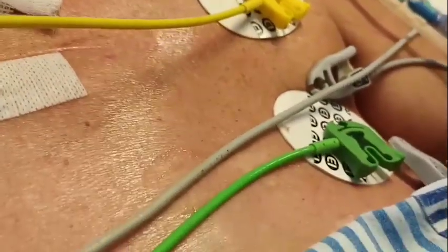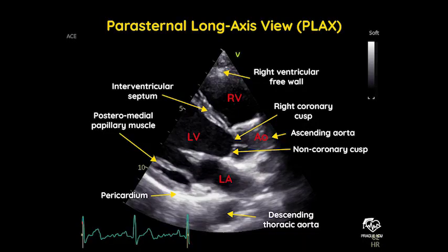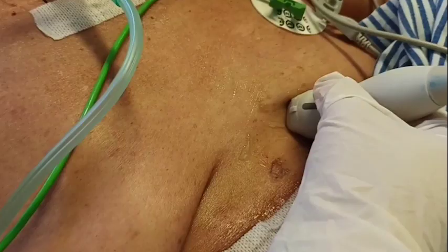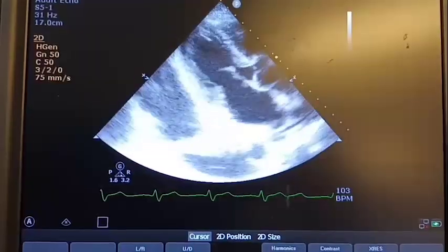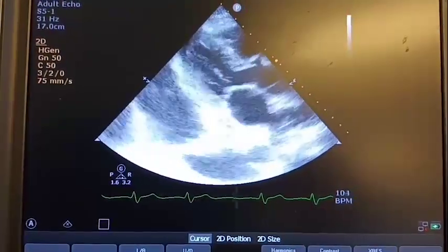Step 1: Approach the parasternal long axis view. We will evaluate the left ventricular outflow tract diameter. The probe is placed in the third to fourth left parasternal intercostal space. For the parasternal long axis view, the probe marker is pointed at 10 o'clock or right mid shoulder.